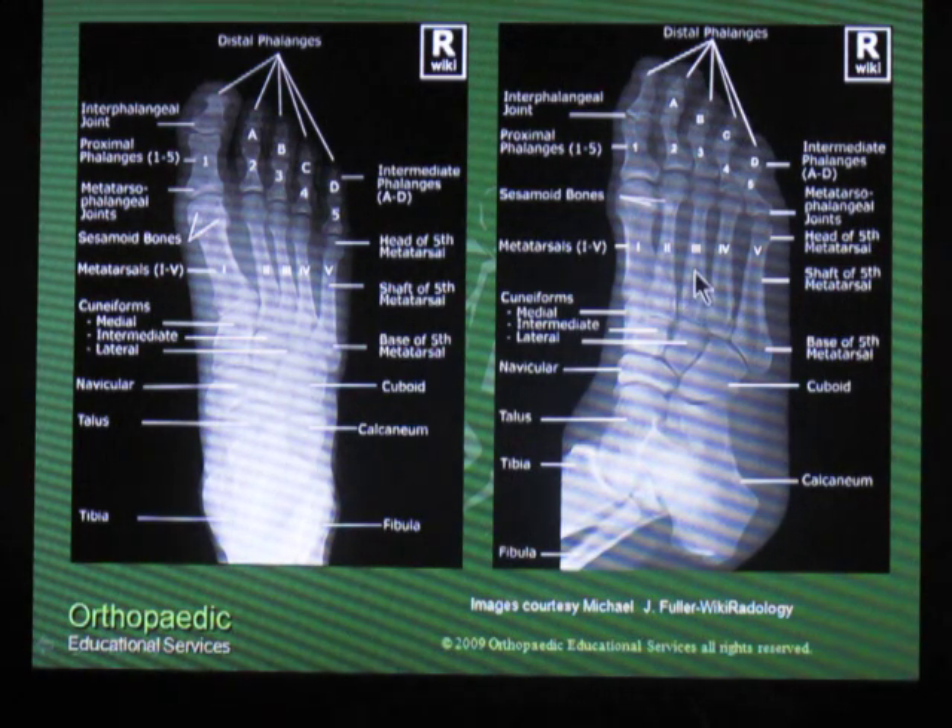On the oblique projection you'll see the third metatarsal shaft, the third cuneiform, and then the fourth and fifth metatarsals and the cuboid all line up appropriately. So when you look at x-rays on a regular basis, especially for normal x-rays, you'll see that the metatarsal shafts and the cuneiform and the cuboid all line up.